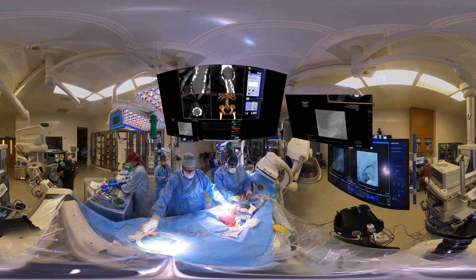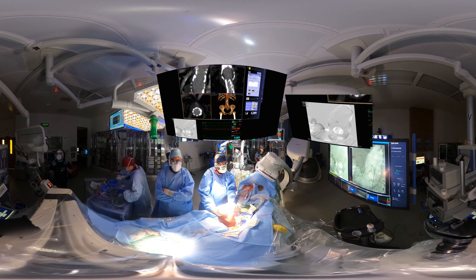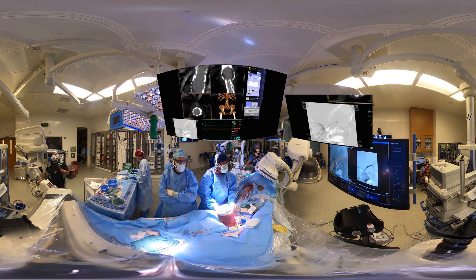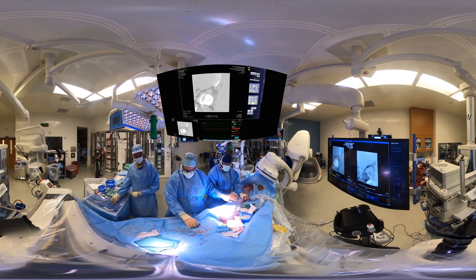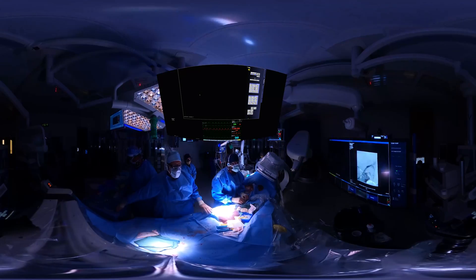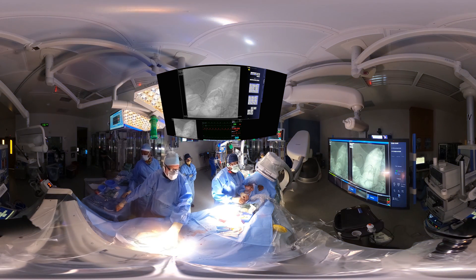When we did the pre-dilation, we actually lost a large branch — the middle colic artery is now no longer visible. So we're going to show you how we manage that. It's very important that any time you have an issue like this, you do not lose the wire, which is across — most likely — a dissection that we have created.